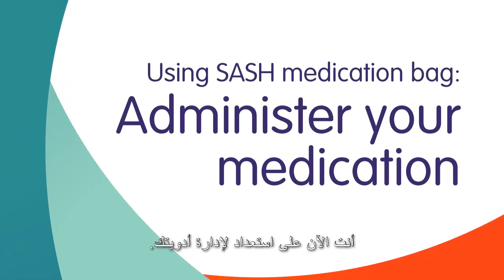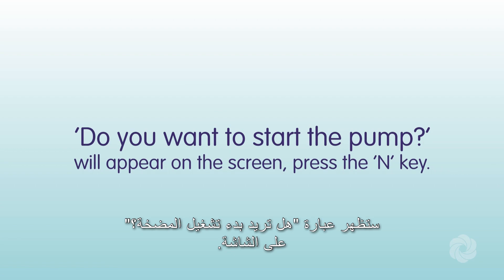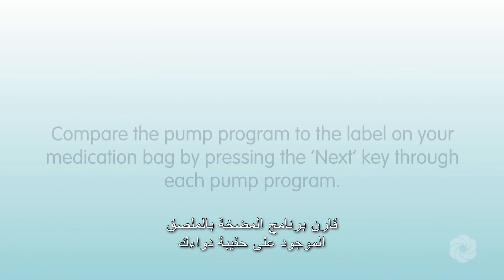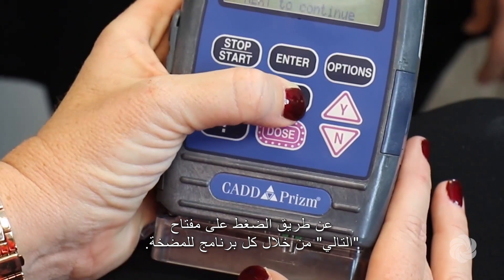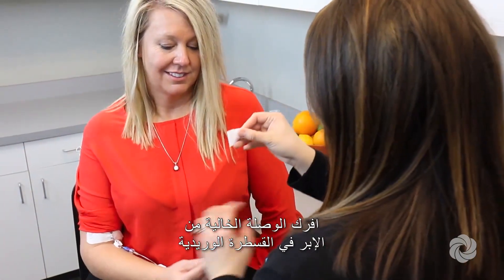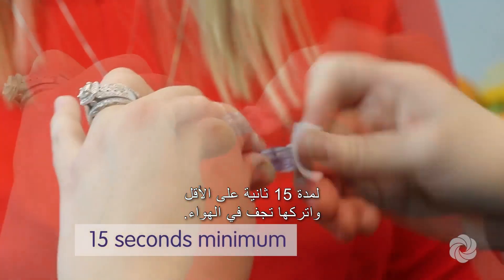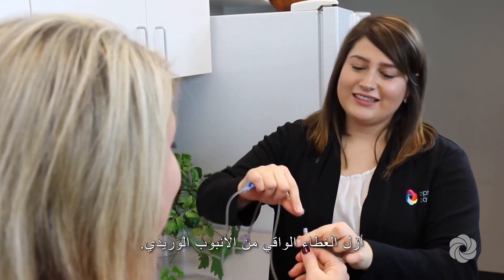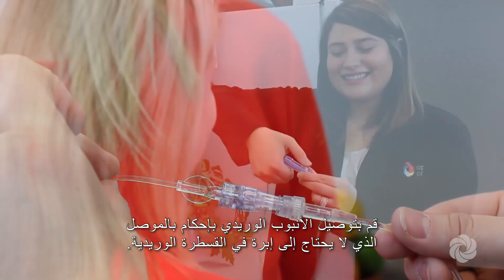You are now prepared to administer your medication. When "Do you want to start the pump?" appears on the screen, press the N key. Compare the pump program to the label on your medication bag by pressing the next key through each pump program. Scrub the needleless connector on your IV catheter for at least 15 seconds and allow to air dry. Remove the protective cap from the IV tubing and attach the IV tubing firmly to the needleless connector on your IV catheter.